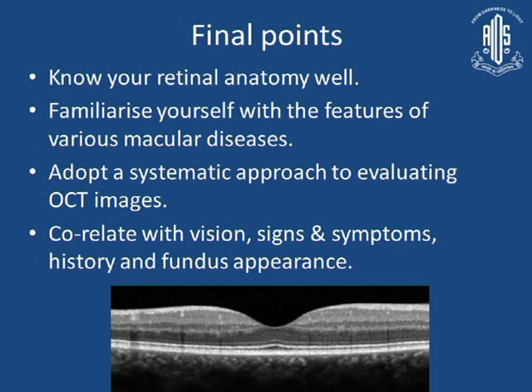So finally, for a good accurate OCT reading, you should know your anatomy very well, the features of the various retinal diseases, evaluate the scan very systematically, and correlate with the fundus features as well as with the history of the patient.